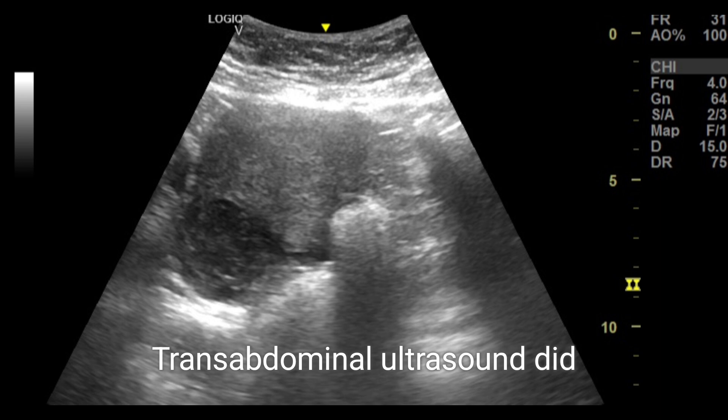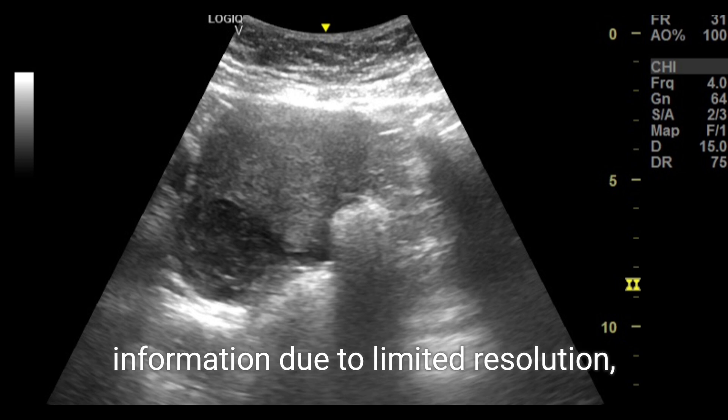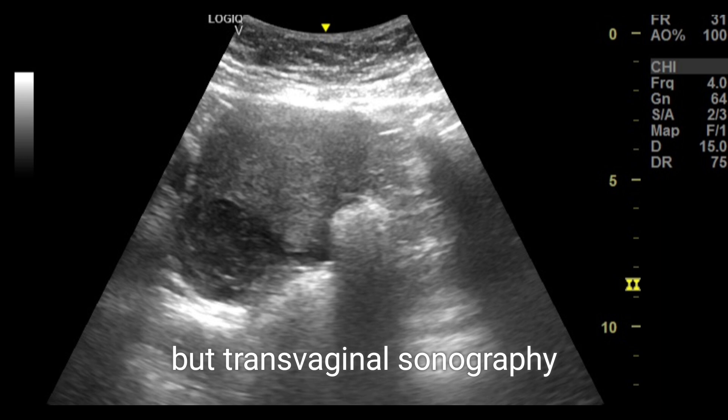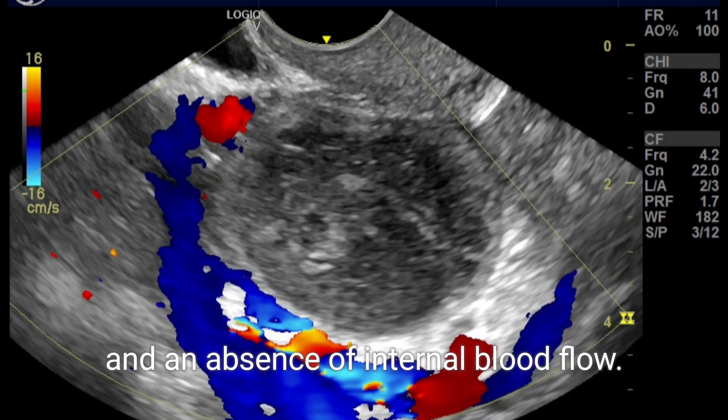Transabdominal ultrasound did not provide conclusive information due to limited resolution, but transvaginal sonography (TVS) revealed multiple thin septations and an absence of internal blood flow.